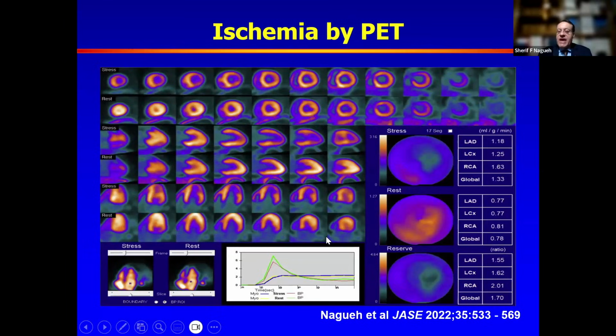These perfusion defects turned out not to be due to epicardial disease, but is part of hypertrophic cardiomyopathy. These patients have a supply-demand mismatch many times. And if you look also at coronary flow reserve for the individual territories, it is reduced in these patients. Part of it is because the resting blood flow is higher, and since the flow reserve is a ratio, that ends up being reduced. So be aware of a stress test that is positive in someone with hypertrophic cardiomyopathy, particularly the apical pattern as I show here.